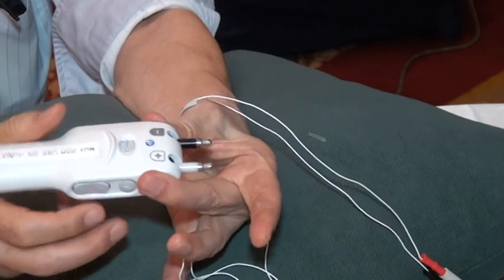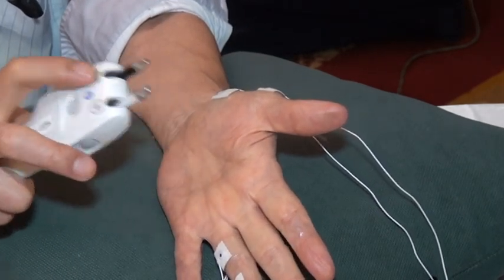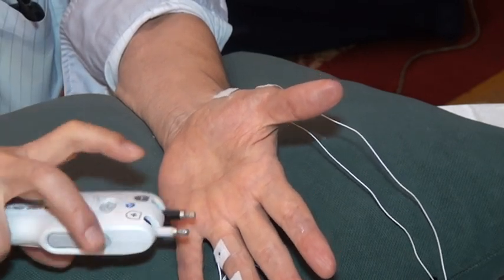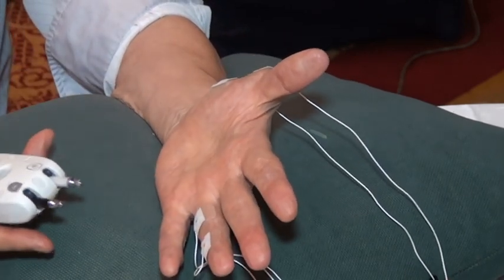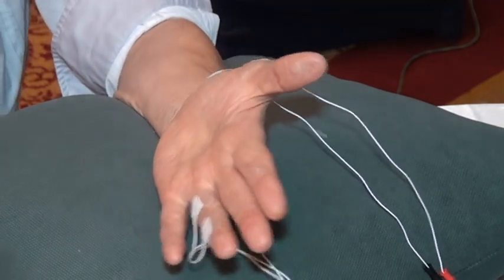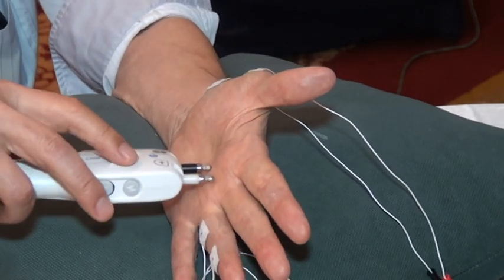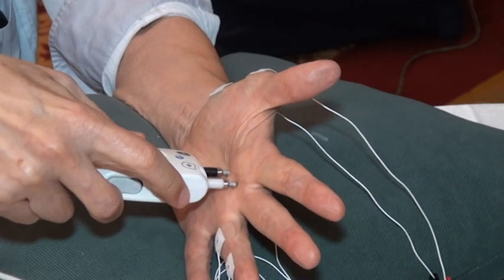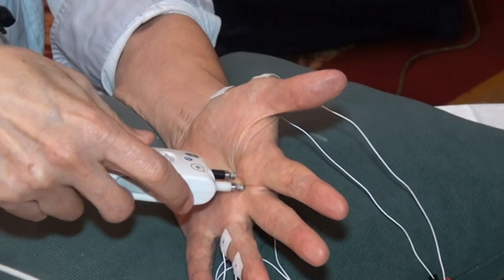Now this time, I'm going into the thumb. So cathode is up. Remember, the principle is the cathode faces the pickup electrode, not the other way around. Because under the anode, you may have hyperpolarization. Actually, it doesn't happen, but theoretically, we don't like it, right? So when I stimulate way over here, very distantly, I stimulate. Do you have sound? Yeah. Put the sound.